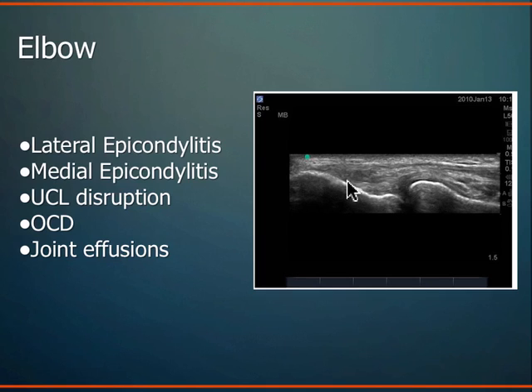So the tennis elbow is really a tendon disorder. And so the epicondylitis is a little bit of a misnomer, but what you're dealing with mostly is tendon pathology or tendon abnormalities. And so on tennis elbow, a lot of times you can visualize that tendon quite nicely. And this tendon has this fluid collection here, disruption of normal tendon fibrillar pattern. It's a little bit thicker. So this is a tendinopathy or probably a chronic tennis elbow. And you can see that quite nicely here.